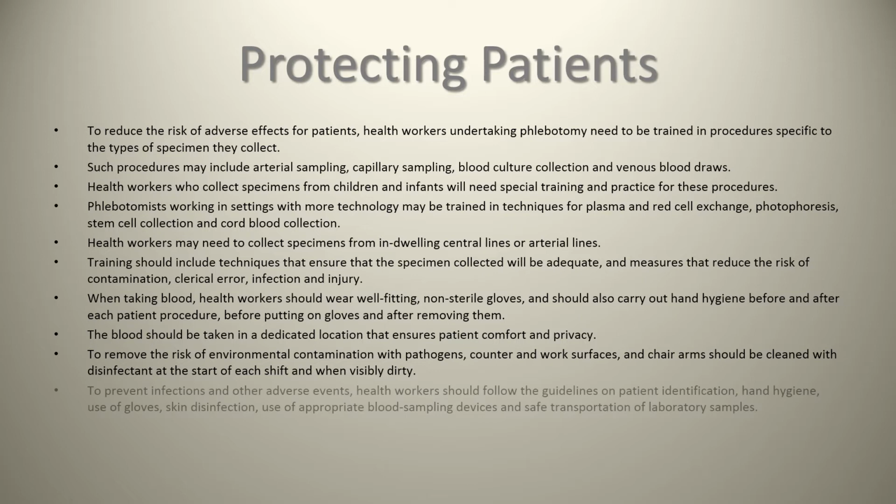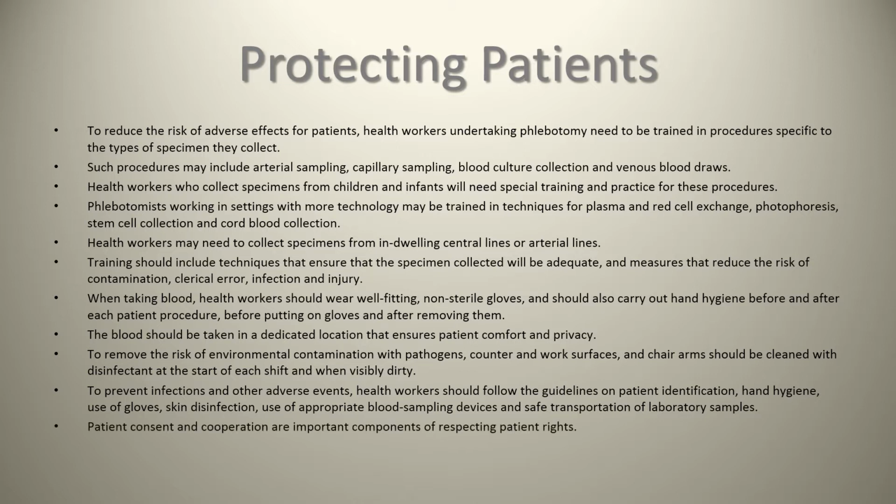To prevent infections and other adverse events, health workers should follow the guidelines on patient identification, hand hygiene, use of gloves, skin disinfection, use of appropriate blood sampling devices, and safe transportation of laboratory samples. Patient consent and cooperation are important components of respecting patient rights. A patient information leaflet or poster that explains the procedure in simple terms is always helpful. So what about protecting healthcare workers?